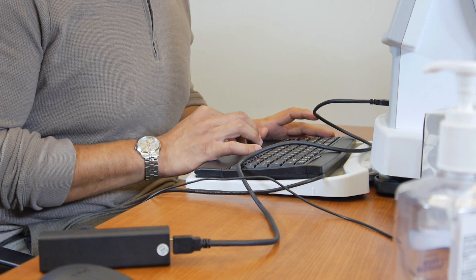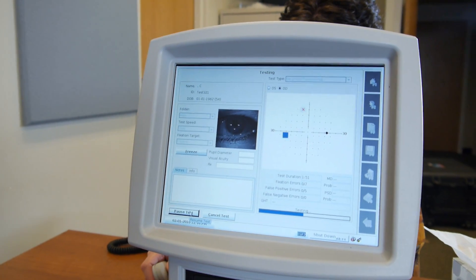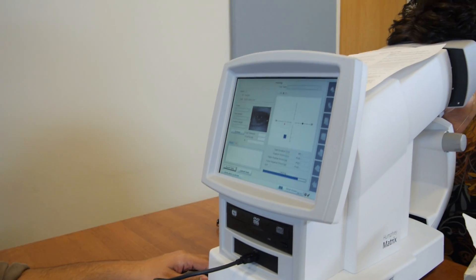Tell the patient they will see a shimmering light and to click whenever they see one. Begin the test. Review the test results. If the patient misses a point, repeat the test. We're reviewing the results because we want to eliminate false positives.